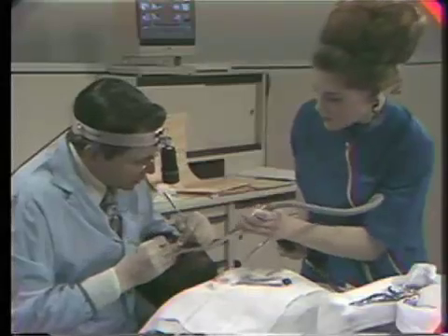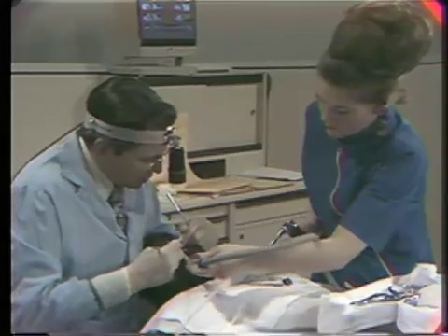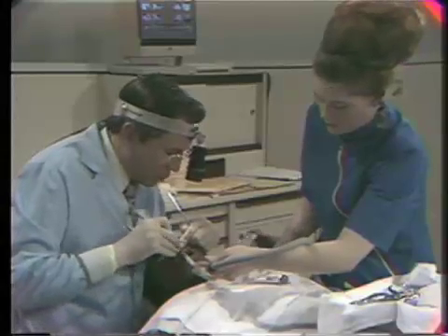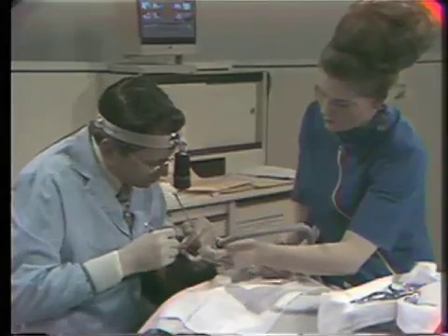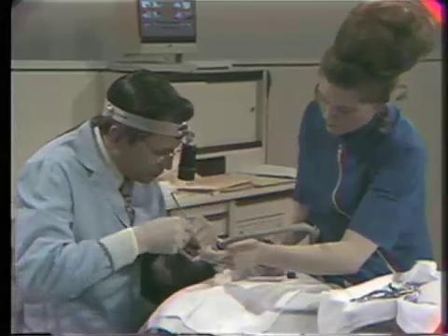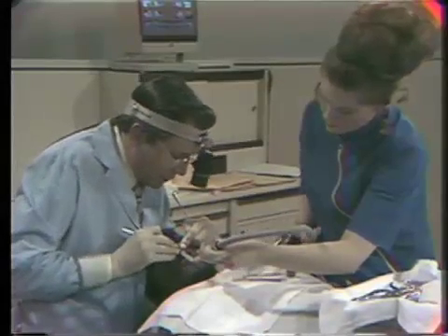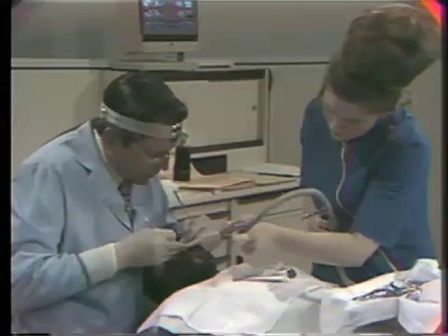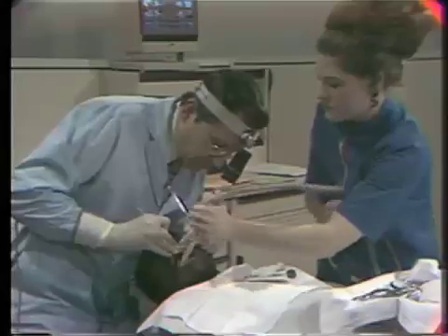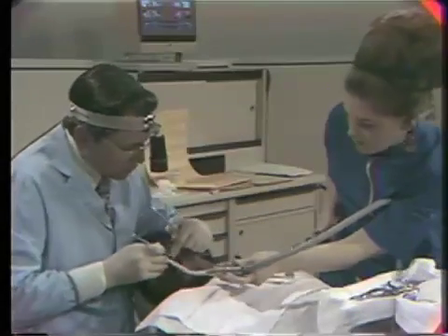So she's been assisting quite nicely during the incision, the removal of the tissue, now the scaling and root planing procedures. All the time keeping the area very free of excess debris, so we have the visualization necessary. And Harry, turn your head a little bit more towards me.